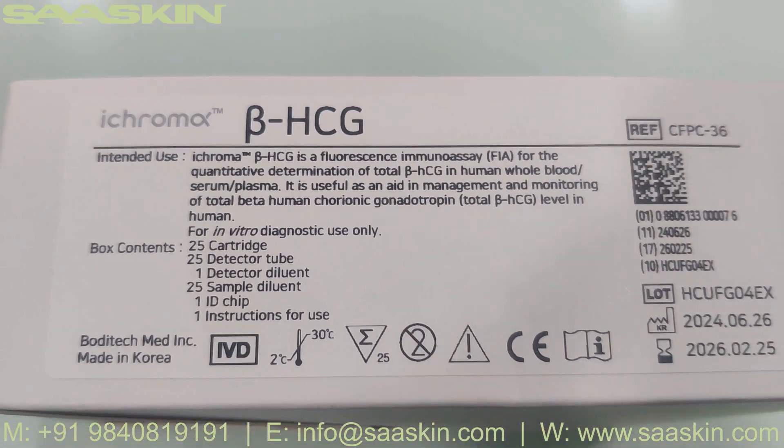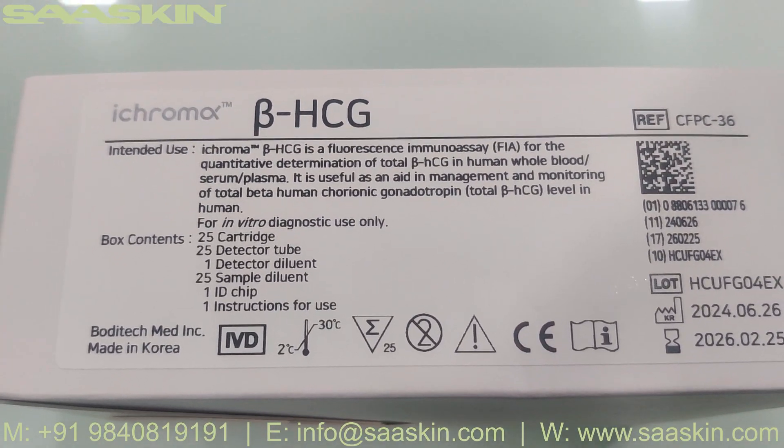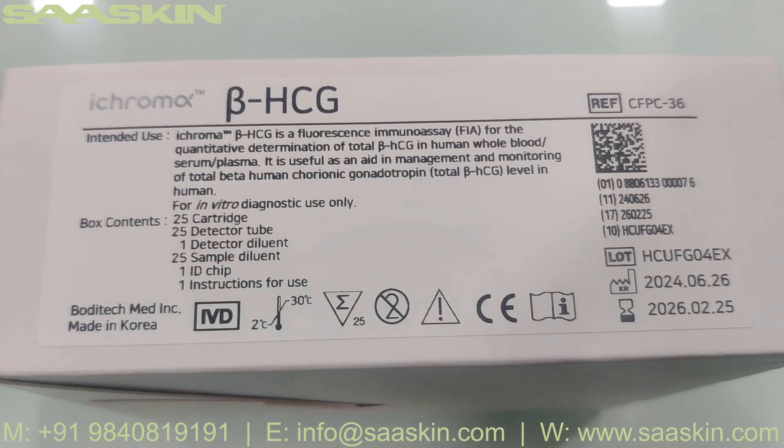The box contains 25 cartridges, 25 detector tubes, 1 detector diluent, 25 sample diluents, 1 ID chip, 1 IFU insert for use, and an IFU brochure.